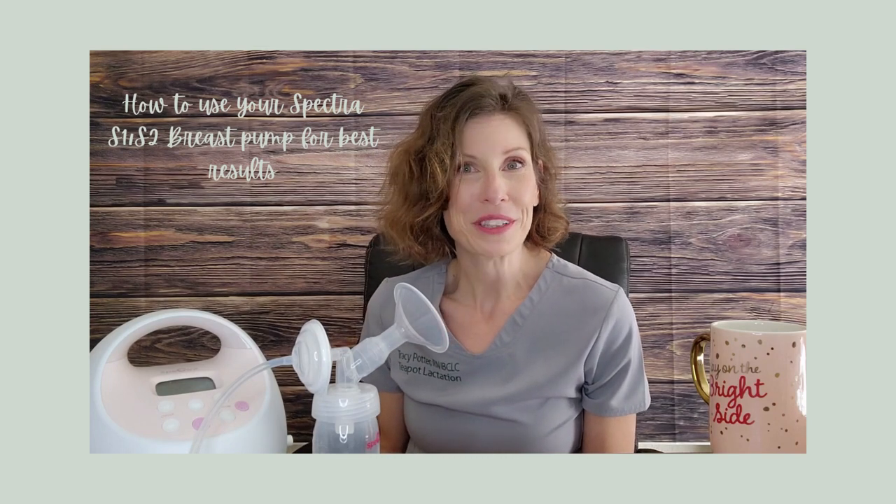Hi everybody, this is Tracy with Teapot Lactation. I'm excited today to bring you my Spectra pump tutorial. I have right here a Spectra S2 pump. This tutorial will work for both the Spectra S1 and S2 pumps, as these are essentially the same pump. The only real difference between the two models is that the Spectra S1, which also happens to be blue, can store a battery charge. I'm going to go step by step, give you a basic tutorial, teach you how to use your pump, what the different buttons mean, and how to get the best results with your breast pump. So, without further ado, let's get started.